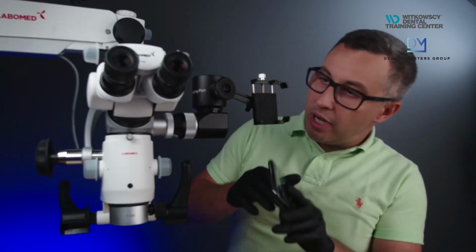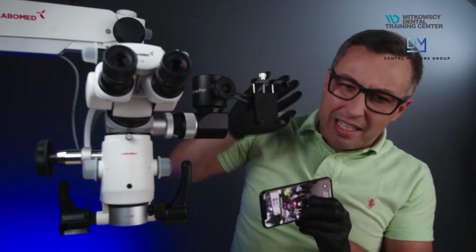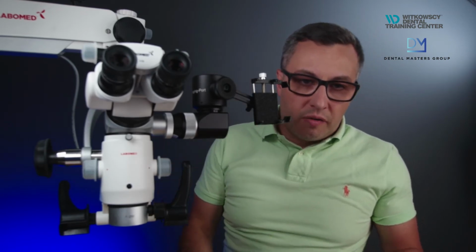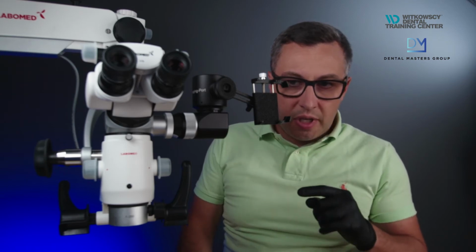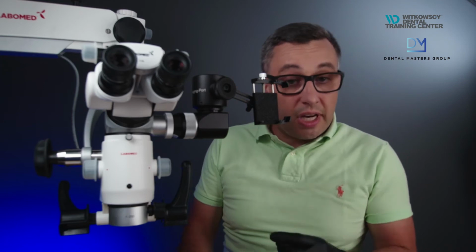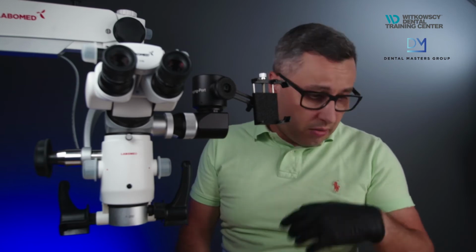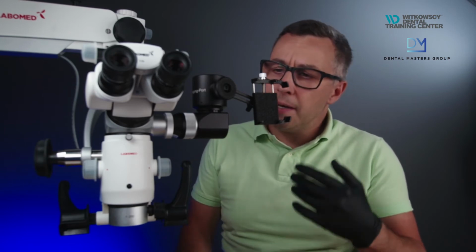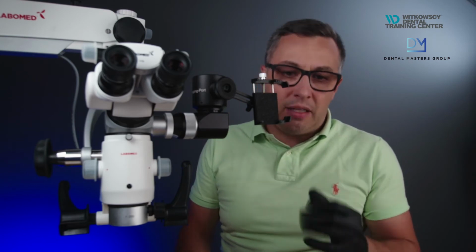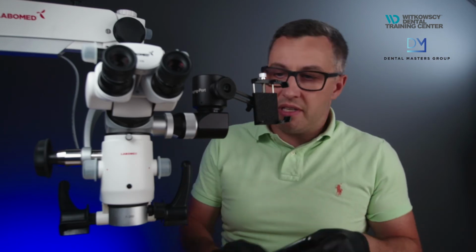So you will see that I'm connecting the phone. I've pre-positioned this before because it's a little bit tricky. It's really quite difficult. So in my opinion, of course, this adapter is great because it can be adapted to a lot of phones. But on the other hand, it's a little bit tricky to position in the beginning. It takes a little bit of time and might be a little bit annoying, but when you set it up for the first time, then all the other times are very easy.